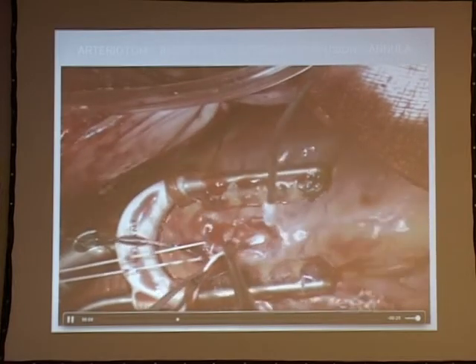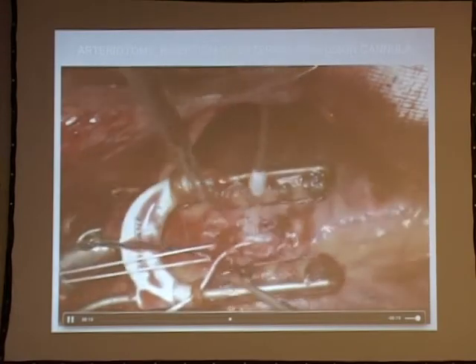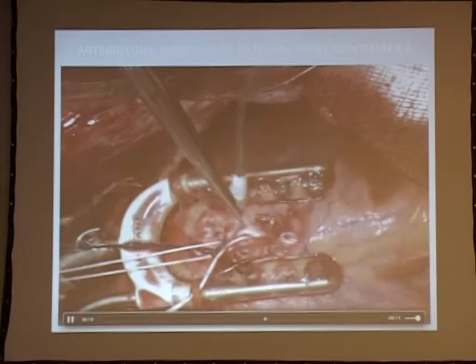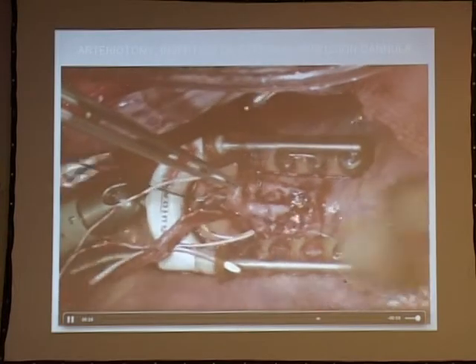So this is the problem. The external shunt was a little bit too large. Eventually, there is some dissection, which was not noticed later. So anyway, I did the CABG, from the ITA-LAD anastomosis, and eventually.